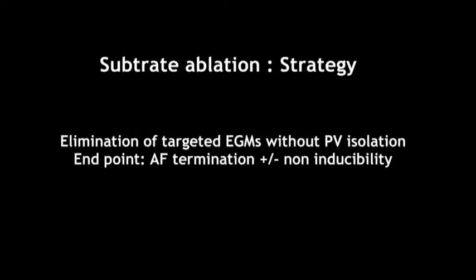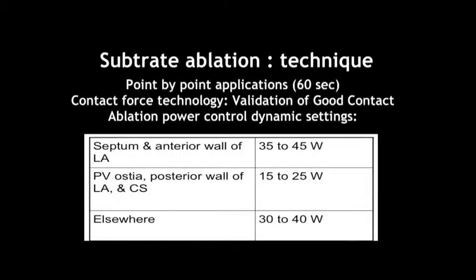Perfect. We start now substrate ablation. The strategy of substrate ablation consists in the elimination of targeted electrograms without PV isolation. The endpoint of the ablation is AF termination and non-inducibility. One minute point-by-point applications are performed using the contact force technology. We use ablation power control dynamic settings.